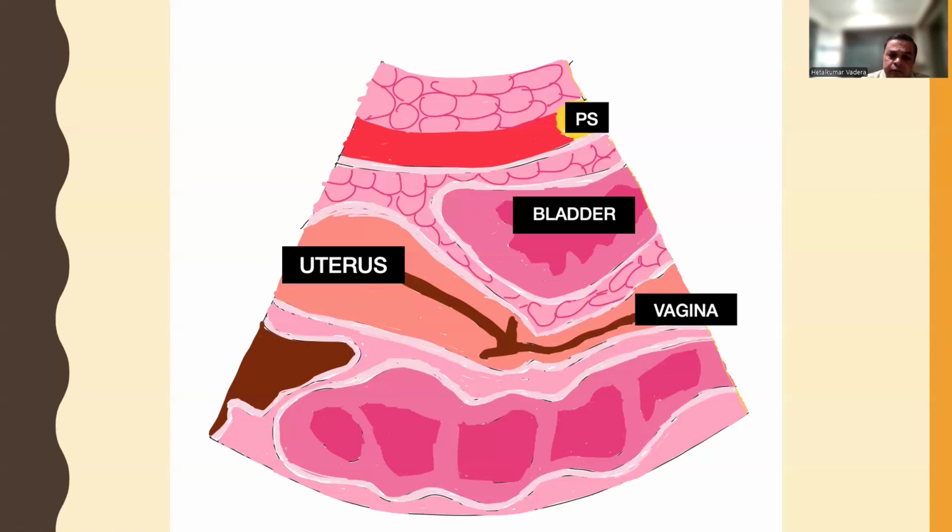Here you can detect the fluid with a lesser amount of fluid, but you have to be careful, especially in the female patient, because there is some amount of physiological fluid in this area. So be careful about it. If you are not getting the fluid, you can give a reverse Trendelenburg or head-up position so that fluid comes towards this area and you can detect it easily. In the same way, in the right upper quadrant view and left upper quadrant view, you can give the Trendelenburg position so that you can detect the fluid easily. So with a small amount of blood, you can detect it.